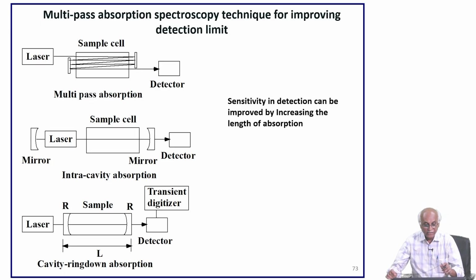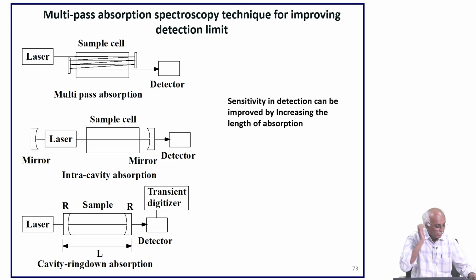So this is regarding how to enhance the sensitivity of the absorption measurement technique that we are discussing.